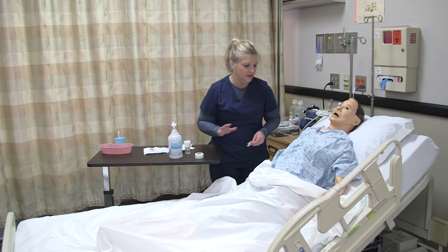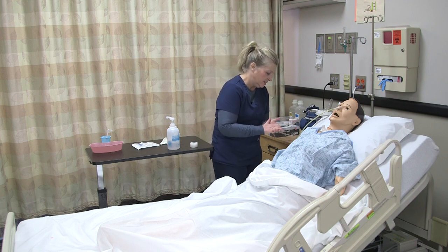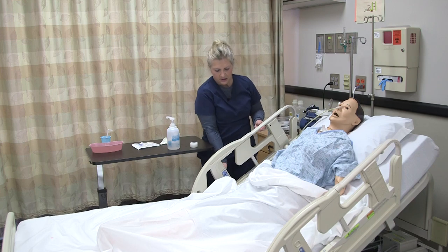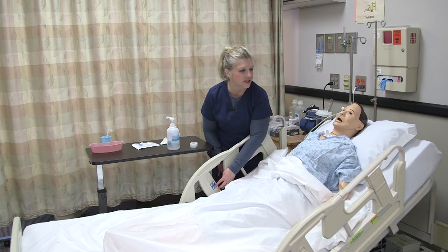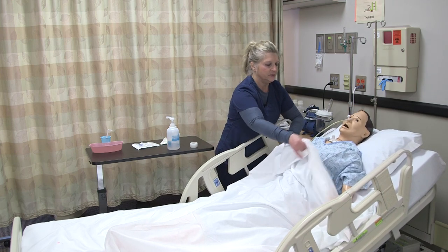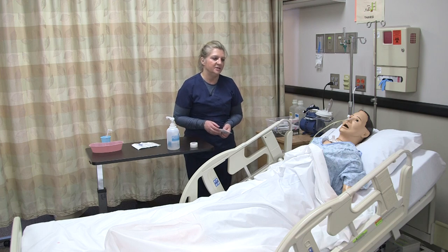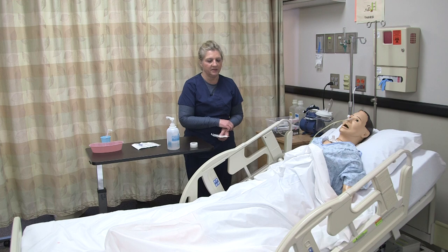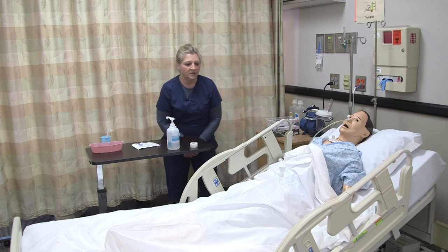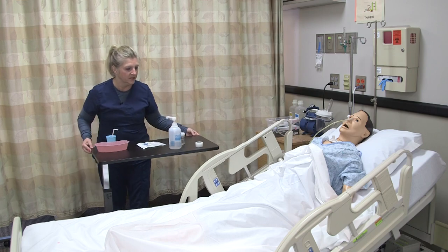Once the procedure is done and everything's been verified, make sure to provide patient comfort. Go ahead and raise the side rail, lower the bed, and do your culture of safety. If the patient can tolerate having the head of the bed elevated, continue to elevate it to prevent any aspiration of gastric secretions. Make sure you document the procedure, any assessments done prior and post, the external length, how you determined correct placement, and how the patient tolerated it. When done, ensure your patient is comfortable, do hand hygiene, and make sure the call light and tray table are accessible.